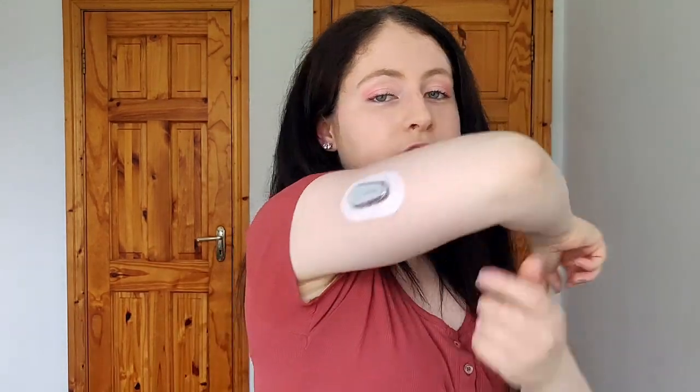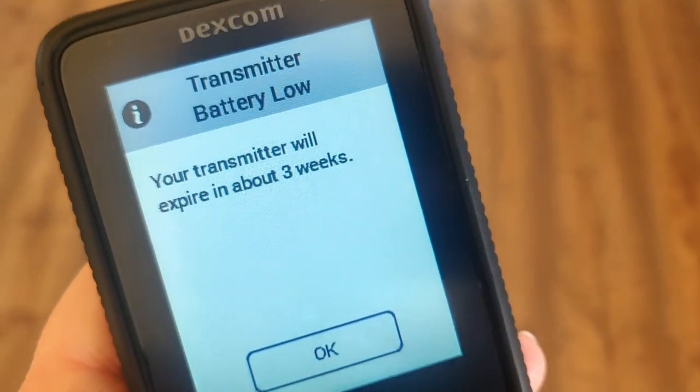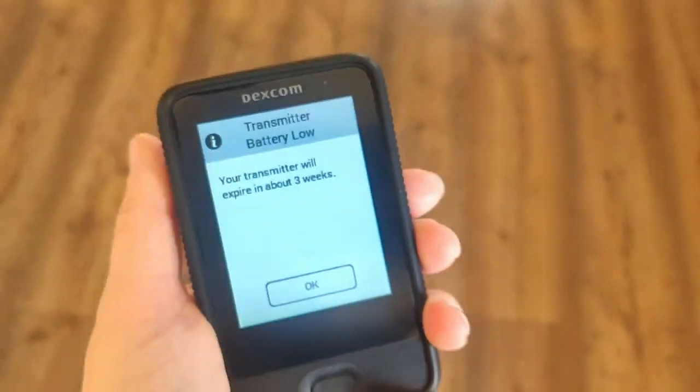This transmitter will last for three months and this sensor will last for 10 days. Remember when you do your next sensor change to hang on to your transmitter. On the receiver it will tell you about your transmitter life — it gives a percentage. When it's nearing expiry it comes up on the receiver. I got warnings saying the transmitter is going to end about one, two, and three weeks before, so it gives you plenty of notice.